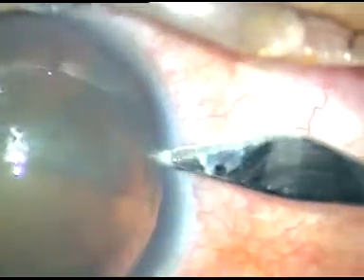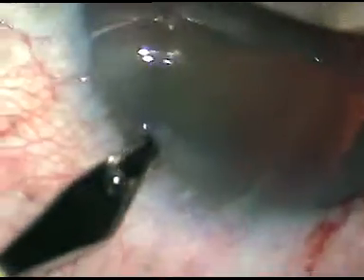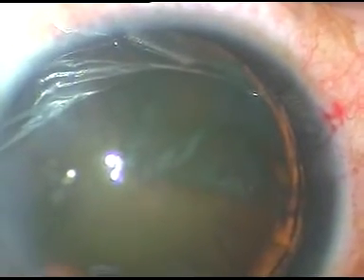Now two side ports are to be made. I make these side ports about 2.5 clock hours away from the main incision. This is the side port on the right side of the main incision, and this is another side port on the left side of the main incision. These side ports are about 1.5 millimeter.